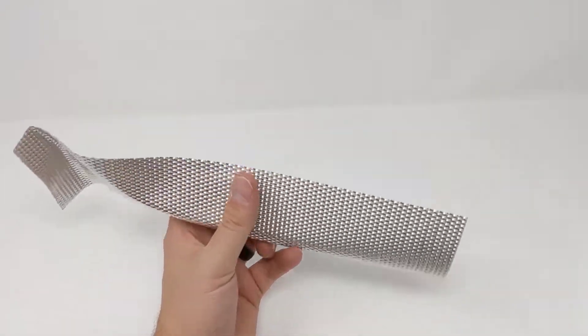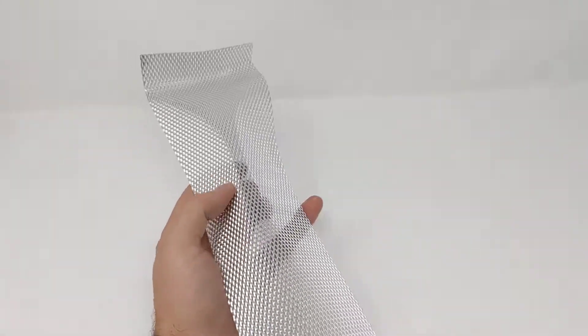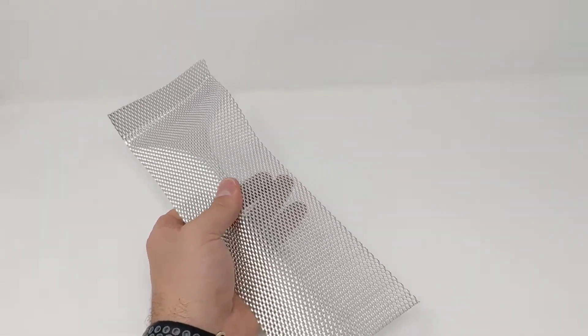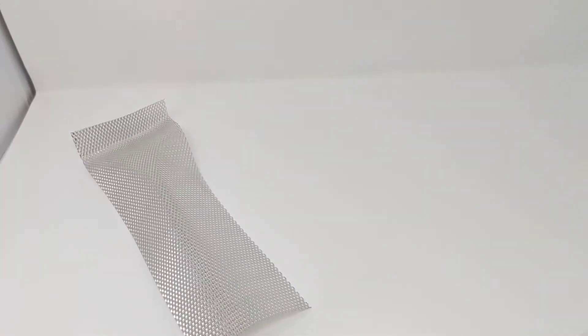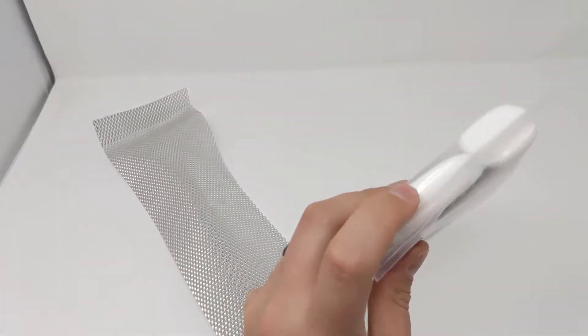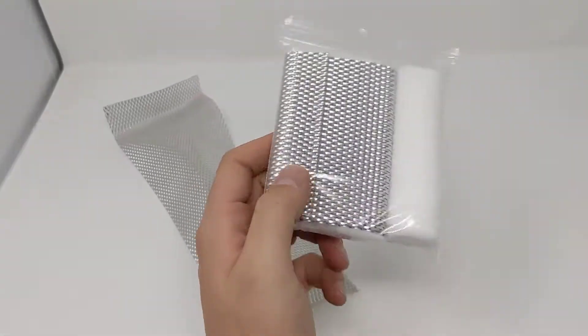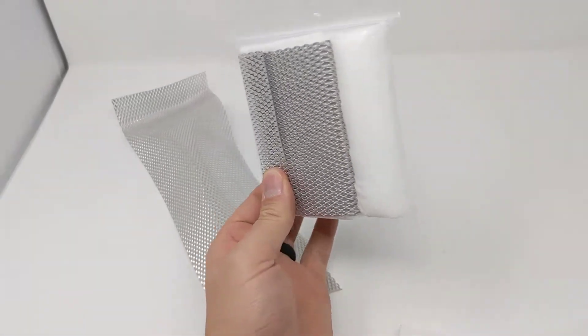This is our brand new wire splint. This is basically the guts of a SAM splint or moldable aluminum splint without the padding on it. The advantage of this is it can actually be folded and stored quite compact. You can pack in padding in between it as it's folded and even some roller gauze and make a splint kit that's super small and portable.